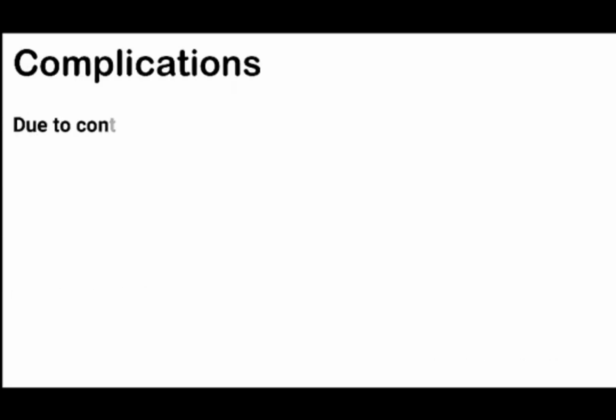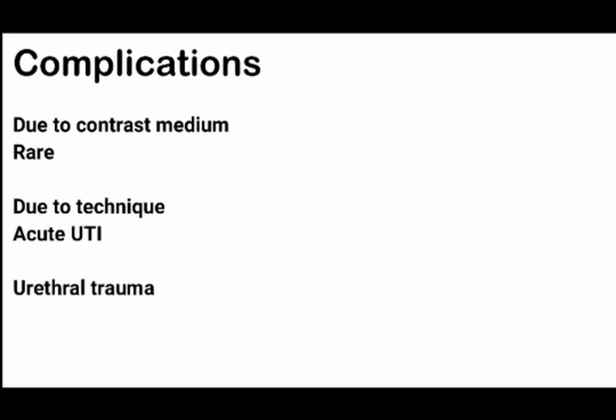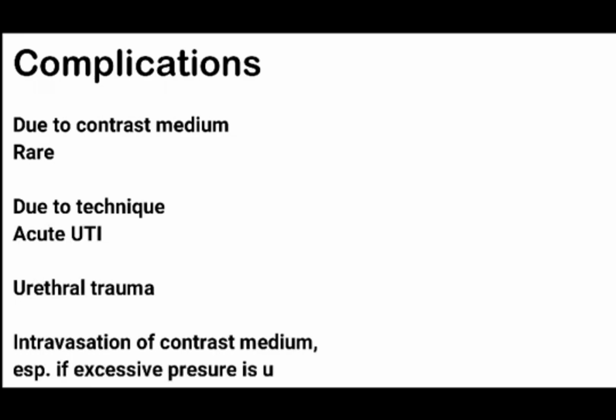Complications. Due to contrast medium: rare. Due to technique: acute UTI, urethral trauma, and intravasation of contrast medium, especially if excessive pressure is used to overcome a stricture.